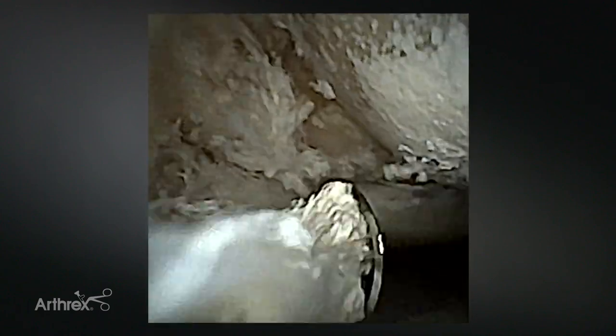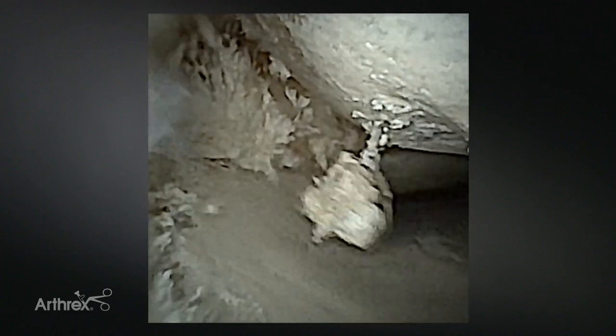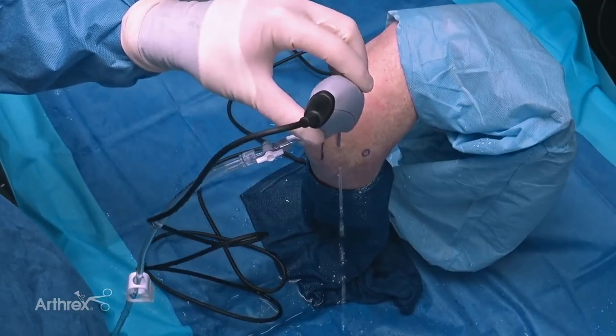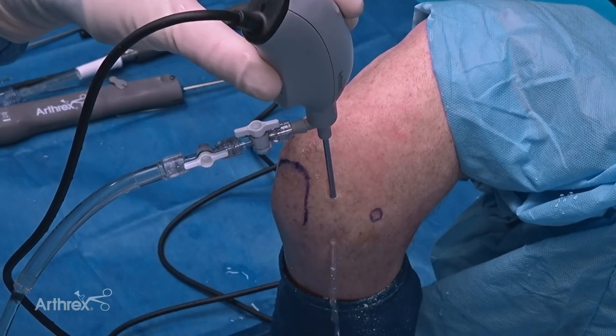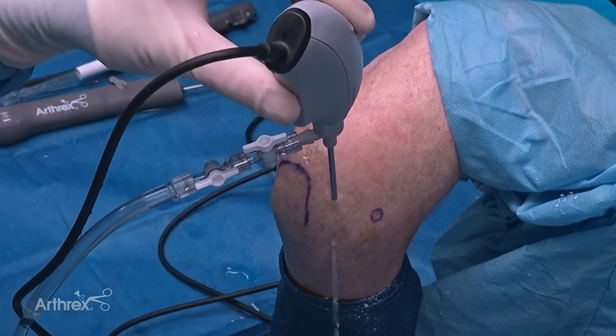That's a nice, safe, and easy way to access the anterior elbow under direct needle localization and visualization. Here I can see my trocar coming from the posterior aspect of the elbow, which gives you a lot of opportunities to treat either radial head defects or capitellar defects. Now we're looking at the radiocapitellar joint - I'm viewing from a proximal posterolateral portal down into the gutter, and I also have a soft spot working portal just below it.